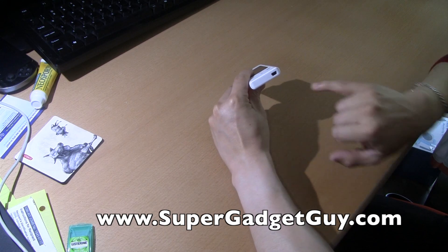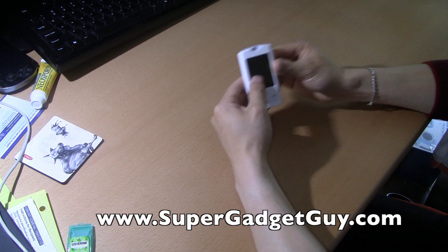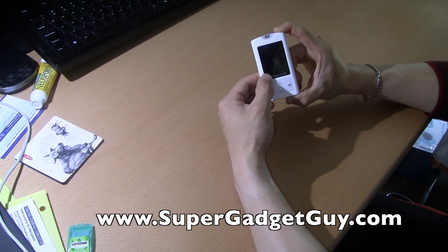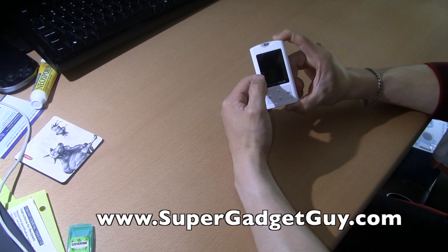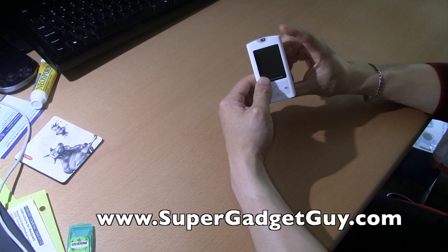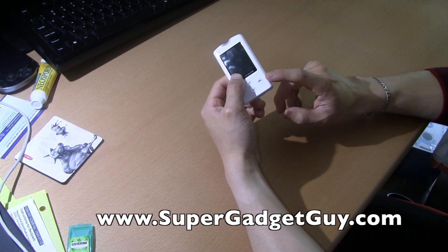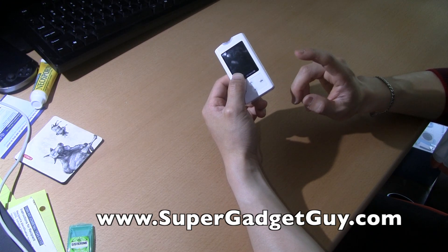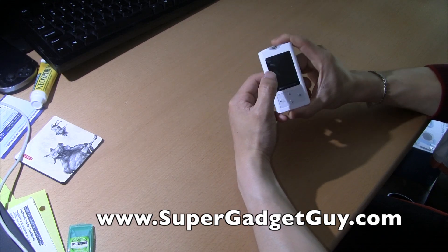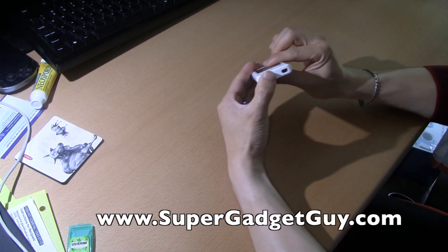Another thing is that it has a USB port — not a mini USB, but a standard USB cable — so you can download data to your computer pretty easily. The software is PC compatible only, not Macintosh. If you have a Mac, forget about it. You need to keep the cable to both charge the meter and download the data. I often find myself connecting it to the computer just to charge the battery, not to transfer data, because the battery life is not that great.